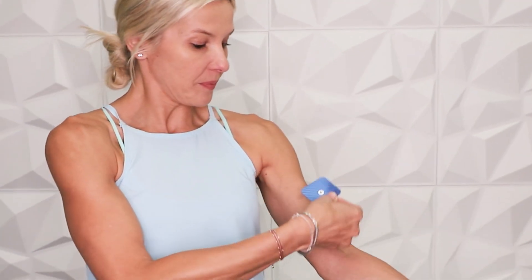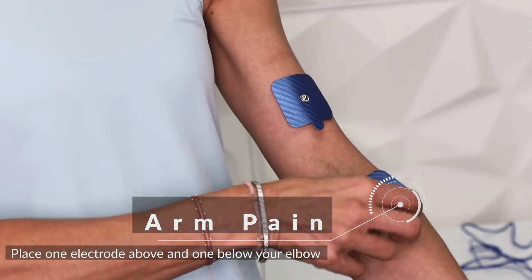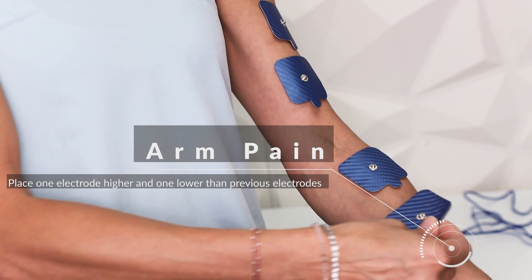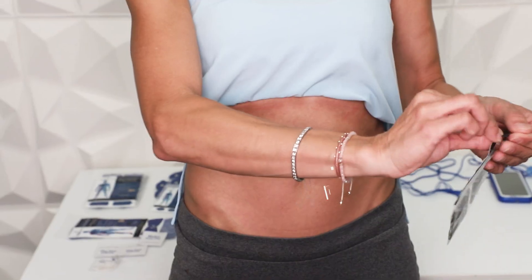For arm pain, place one electrode above your elbow and one below your elbow. Then place one electrode higher than the one above your elbow and one below the electrode underneath your elbow.